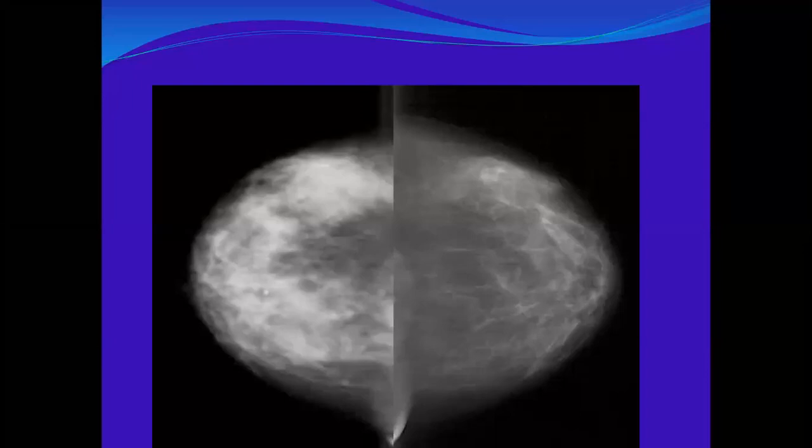This is mediolateral projection. If any other projection. Okay, there is no other projections. Like such a patient, I proceed for ultrasound. You will proceed for ultrasound, but I don't agree with you on one point.